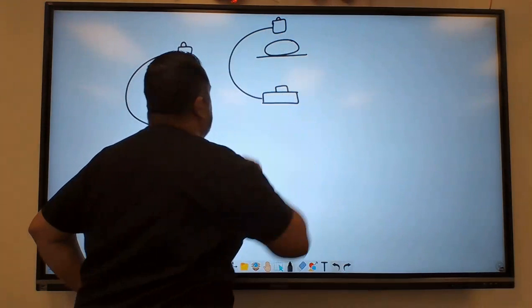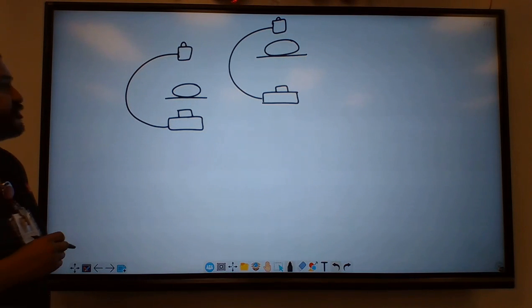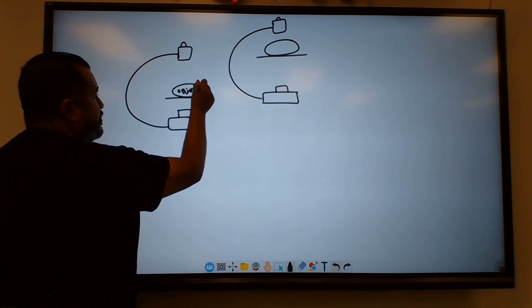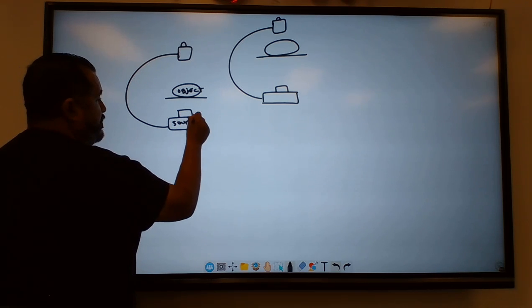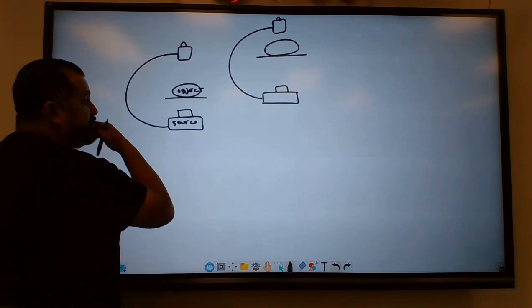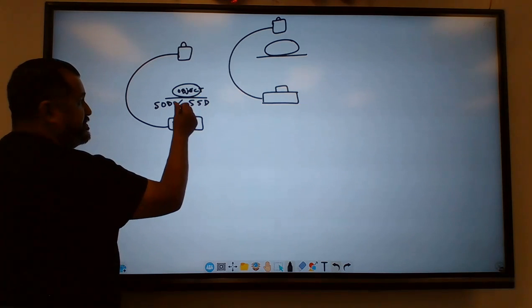Let's say we're working either with a fixed unit or a C-arm. It doesn't matter. It's preferred to have the x-ray tube down underneath, right? So take a look here. Here's the object. The object is the patient, correct? Here is the source of x-rays. Now, this distance, source to object distance, we said it was SOD, but now I want you to use the term source to skin distance.